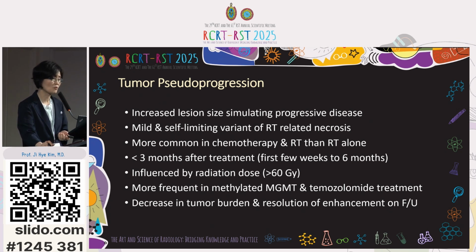Because there are many overlaps between the pseudoprogression and RT-related necrosis, it is not incorrect to say that pseudoprogression is a mild and self-limiting variant of the RT necrosis. It is commonly seen when both chemotherapy and RT were performed rather than RT alone. The patient usually presented less than 3 months after the treatment, ranging from first few weeks to 6 months.